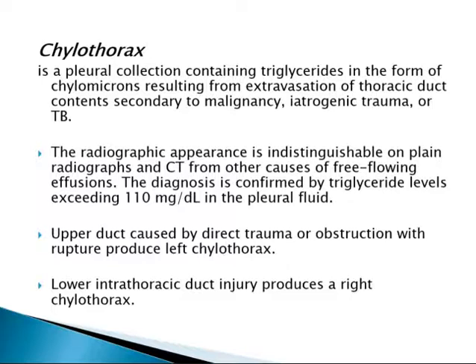Chylothorax is a pleural collection containing triglyceride, secondary to malignancy, iatrogenic trauma, or TB that causes injury to the thoracic duct. The radiographic appearance is not distinguishable on plain radiograph and CT from other causes of effusion.